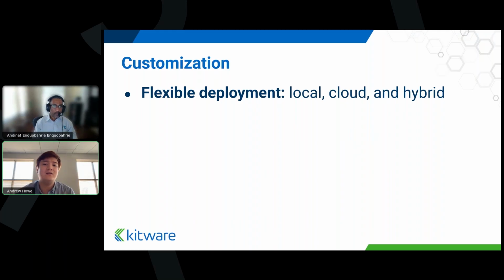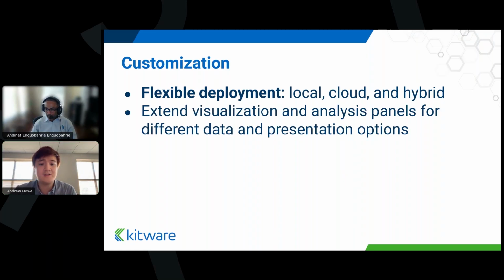and continued with the distributed architecture of VolView, so you can deploy any of the servers, whether it be the DICOM server or the FHIR server or the Python machine learning AI backend, on the cloud or locally. So it opens up opportunities for scaling the backend as needed based on the size of your model, and you could take advantage of cloud providers that offer different resource plans. Additionally, you can customize the way that the EHR transfers to the viewer, just as somebody asked.